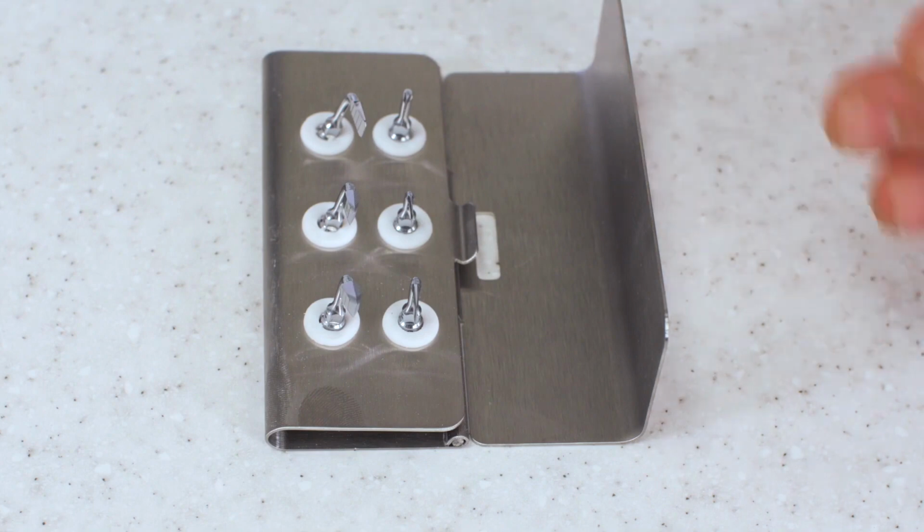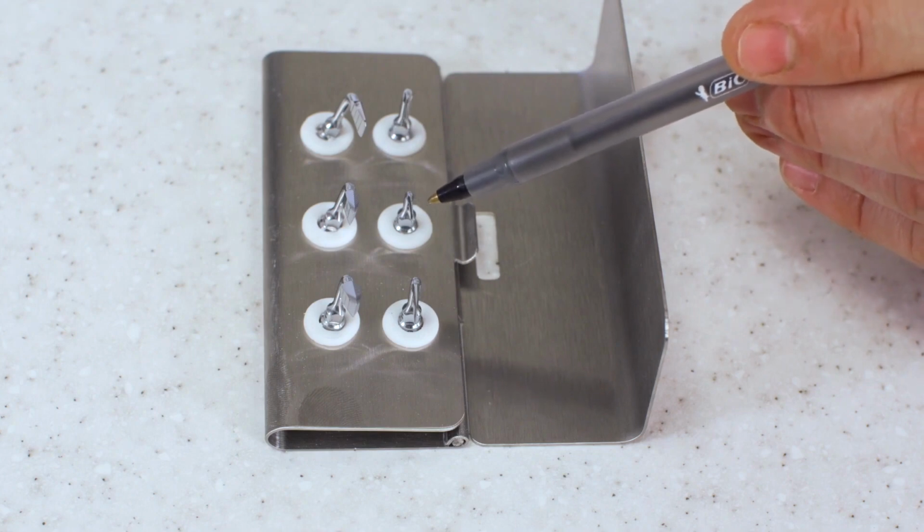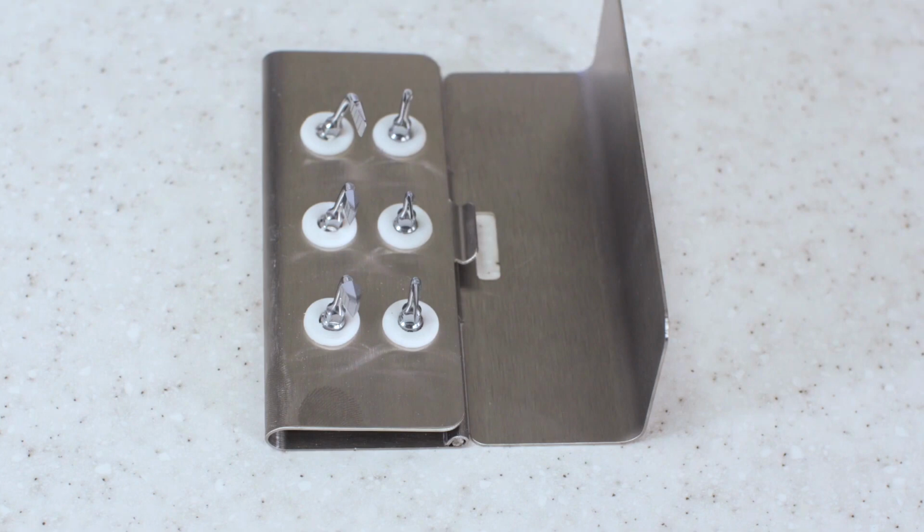There's some thin wedge shapes and some thick wedge shapes so that you can enter in, make your initial osteotomy, take it to depth, and then go through various widening. You can start off with narrow and then wide and then even wider with some of these larger ones so that you can predictably split ridges and increase osteotomy sizes or do bone surgeries.